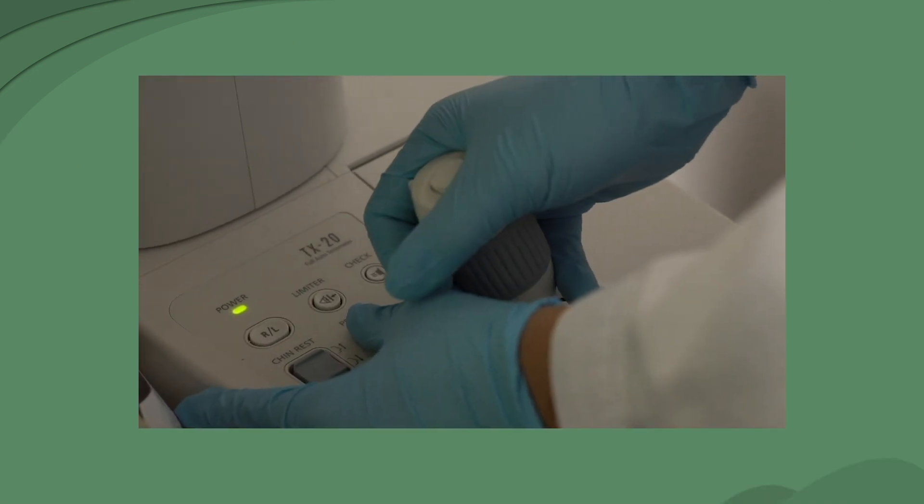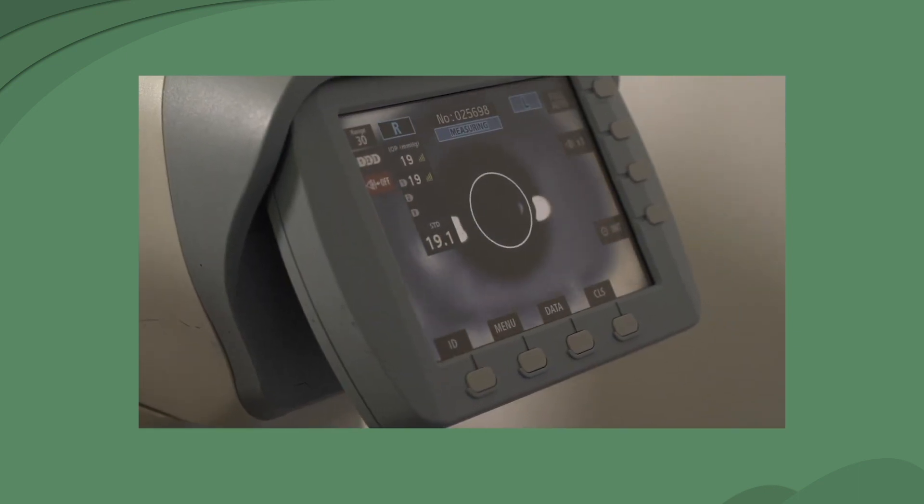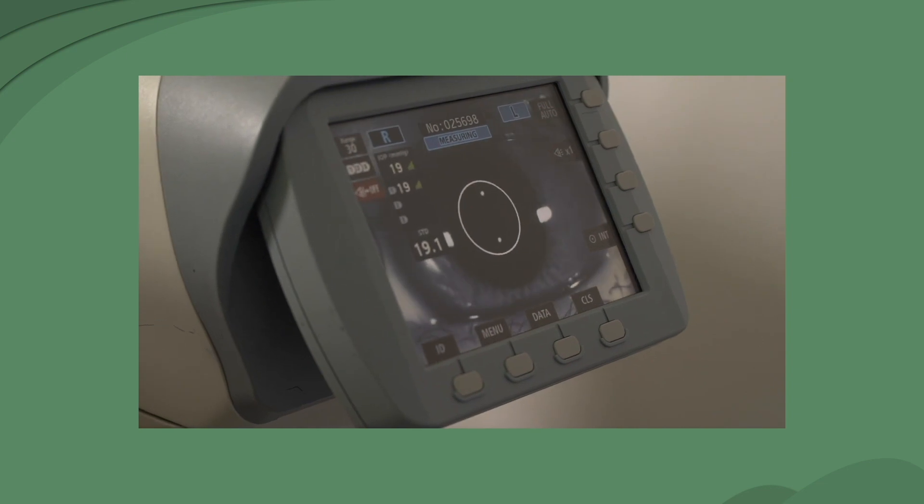There is a non-contact tonometer, which is the most commonly used measure in ophthalmology clinics. The patient sits in front of the non-contact tonometer, puts his or her head on the tonometer head, and keeps the eyes widely open, looking straight ahead. The examiner adjusts the focusing handle, aligns the tonometer pressure head at the cornea, and instructs the patient to look at the green light. When the cornea is focused, the system automatically sends out a burst of air to flatten the cornea, and the intraocular pressure is displayed on the monitor screen.